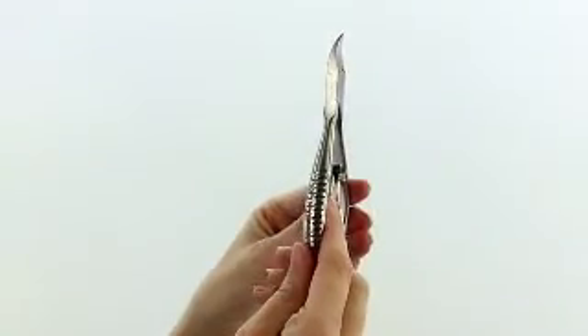The blades of this nipper are very sharp and they have a pointy tip to help fix ingrown toenails. The length of this nipper is about 5 inches long, which gives extra strength and cutting power from the palm of your hand.